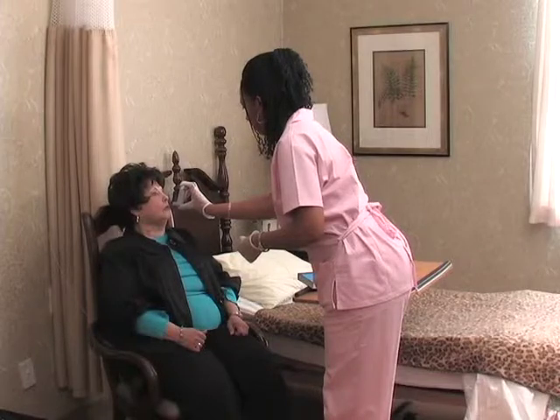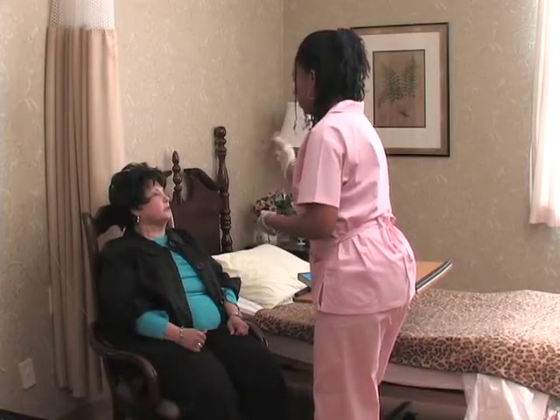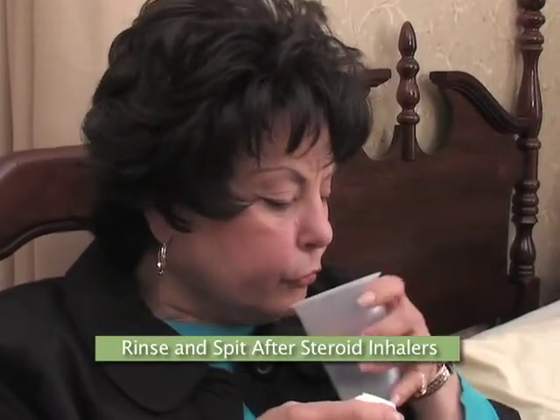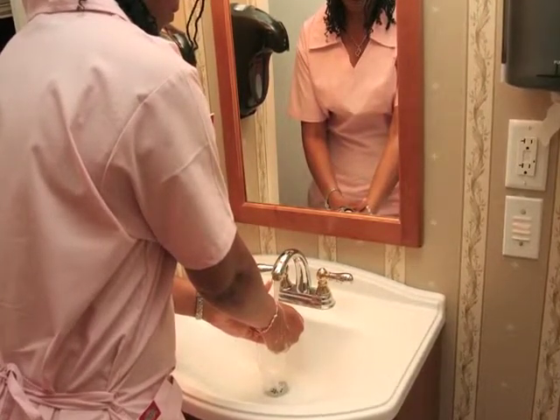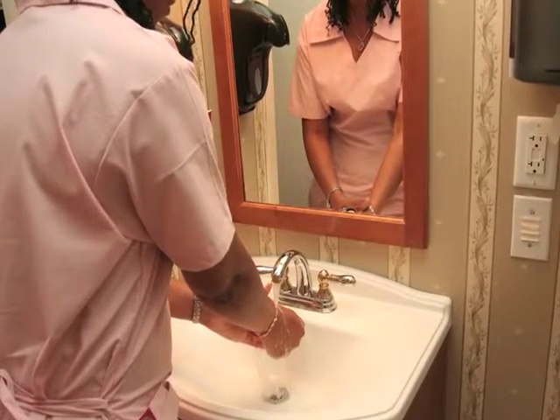The nurse will continue to shake the inhalant as recommended by the manufacturer before repeating the same process for the second puff. If the medication was steroidal, Mrs. Casa is asked to rinse her mouth with water and spit out. The inhaler mouthpiece is cleaned according to manufacturer recommendations or facility policy. Hands are then washed and the barrier is discarded.